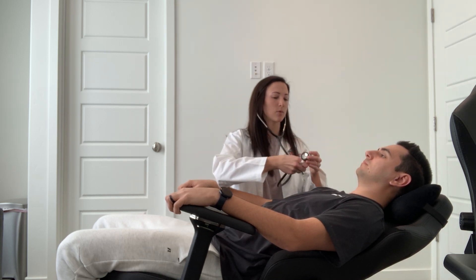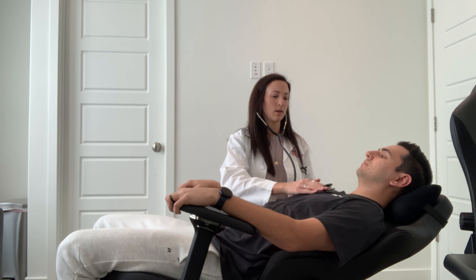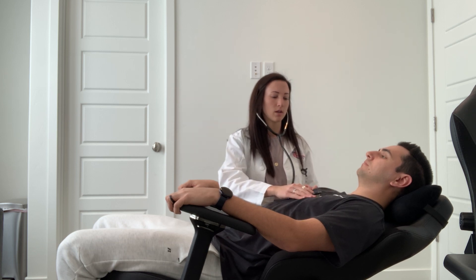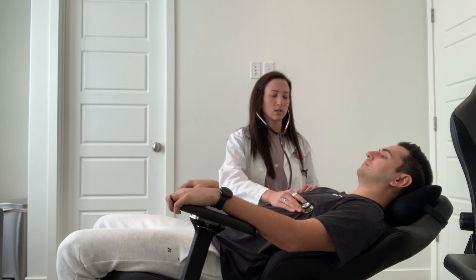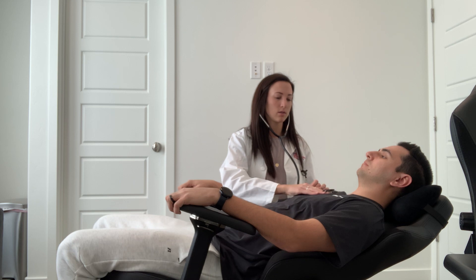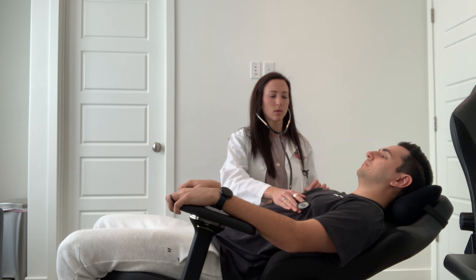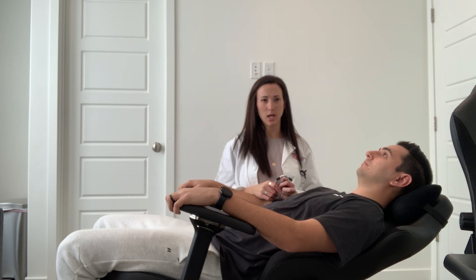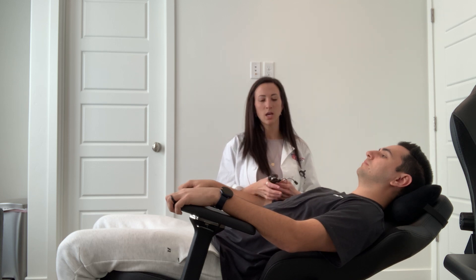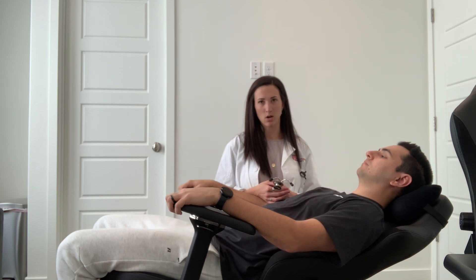Next, auscultate in those same areas — aortic, pulmonic, mitral, tricuspid, Erb's point, and point of maximal impulse — and listen with the bell in those same spots as well. You should do this while they're sitting down and while they're standing up. S1 and S2 sounds are present, no S3 or S4. There's no splitting of the S2, which can actually be normal. A physiologic splitting of the S2 occurs upon inspiration because the lungs are pushing on the heart, making the valves close at separate times. Pathologic splitting would be abnormal — that's when it's also present upon expiration.